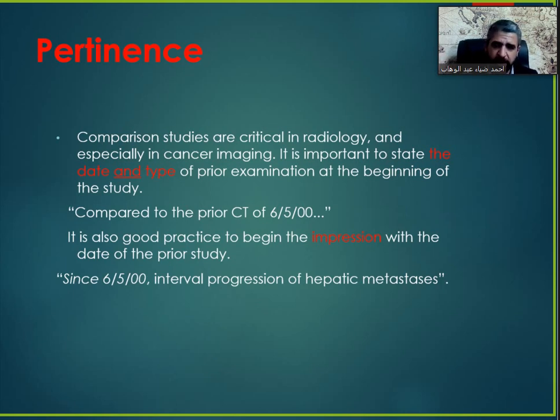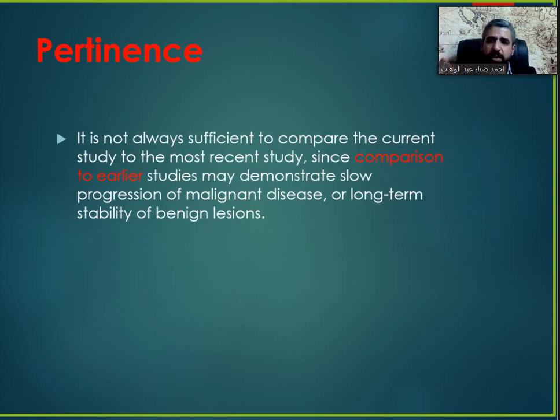For example, impression: since this date, interval progression of hepatic metastasis was seen. It is not always sufficient to compare the current study to the most recent. We usually compare the current study with the most recent study, but this is not enough. Sometimes we need to go to the earlier studies to show that the progression of malignant disease is a slow progression, or the disease is being long-term stable, it did not change over time.